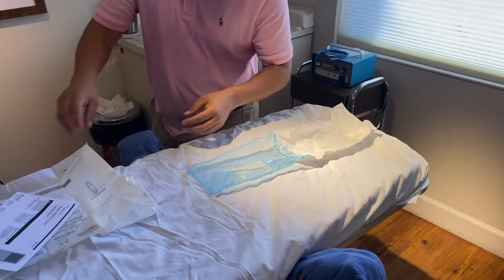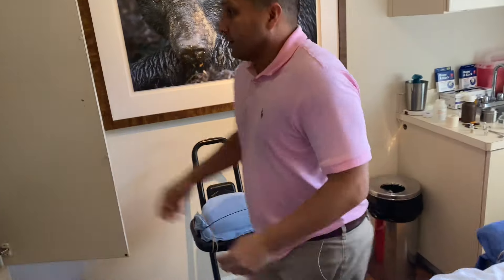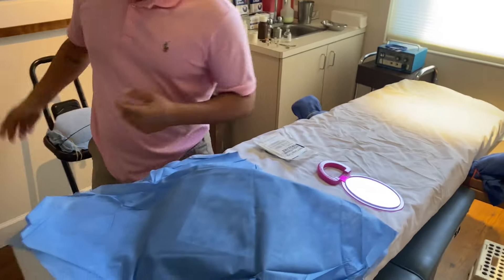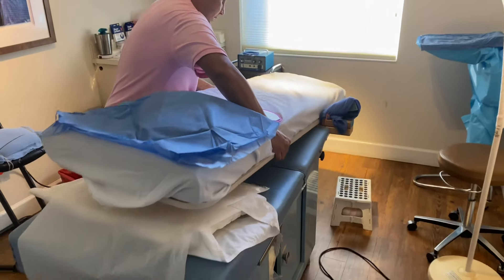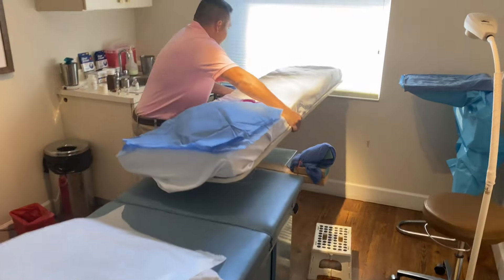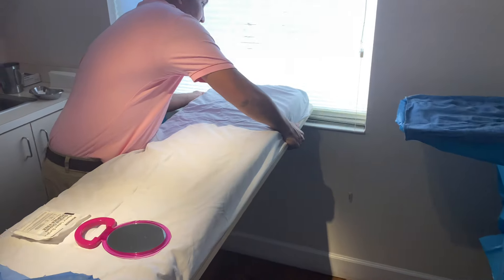Now I'm going to set up the mirror and the size 7 gloves. These go right here. I put them at the end because I don't want to break the mirror. I'll just grab them from here — that's still sterile. Put this on the lip of the window sill and push it in. This is adjustable depending on how tall the patient is.